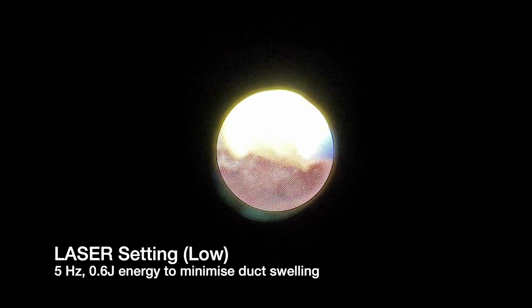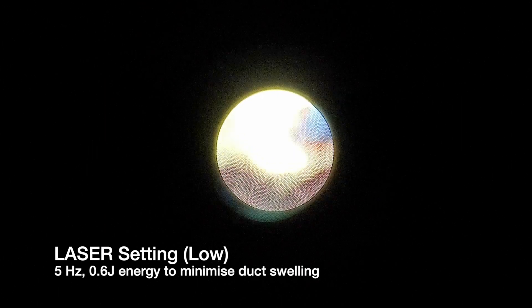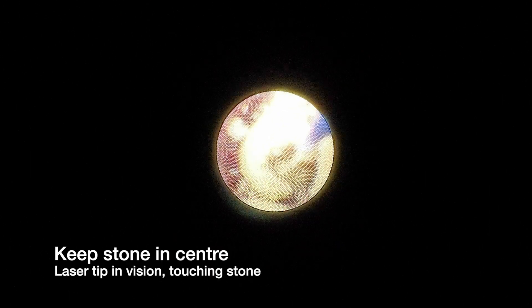This is almost an unedited fragmentation sequence where you can see we are proceeding from the center of the stone towards the periphery, progressively breaking it down into multiple smaller fragments. Care must be taken to ensure the fragments are below the required diameter to pass through the duct. We always take care to stay away from the duct walls.